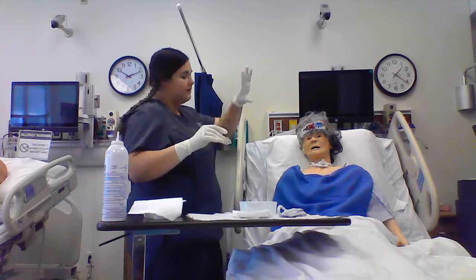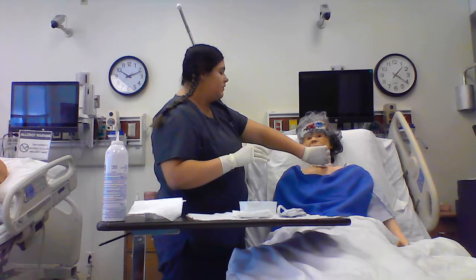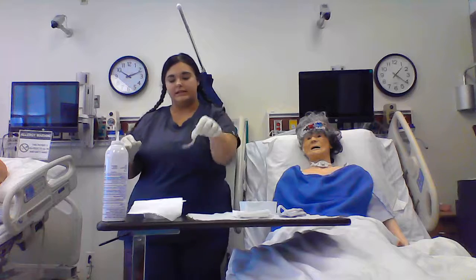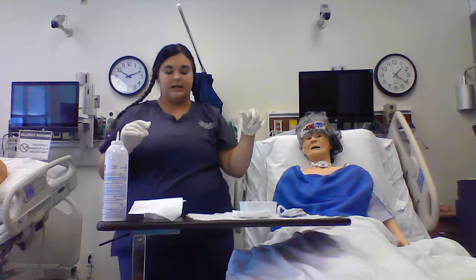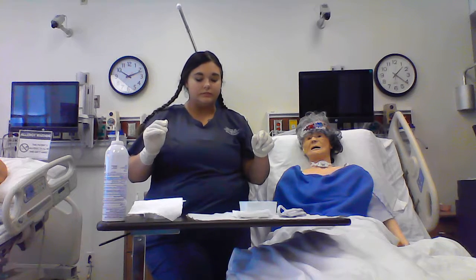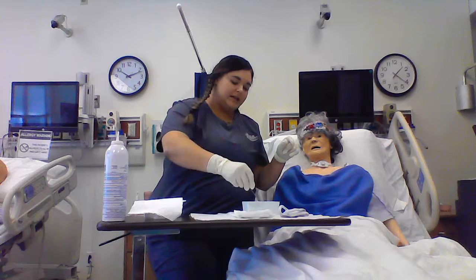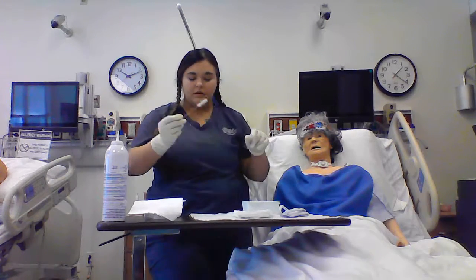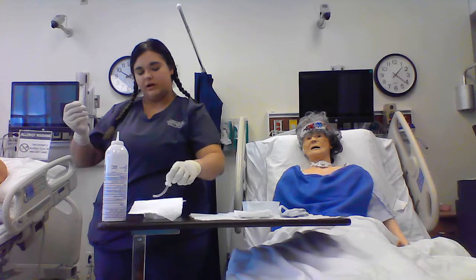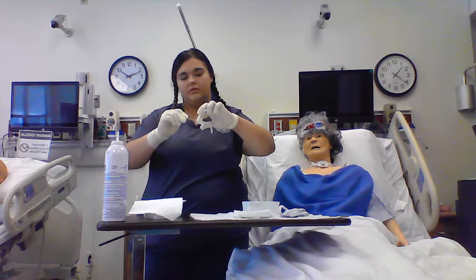Okay. At this point, I'm going to take my non-dominant hand and grab my inner cannula and take it out. And I put this in my hydrogen peroxide mix. I'm going to let it soak for a second. With my dominant hand, I'm going to grab my brush out of my sterile saline. Non-dominant hand, I'm grabbing my inner cannula out of my hydrogen peroxide mixture. And now I'm going to clean my inner cannula.